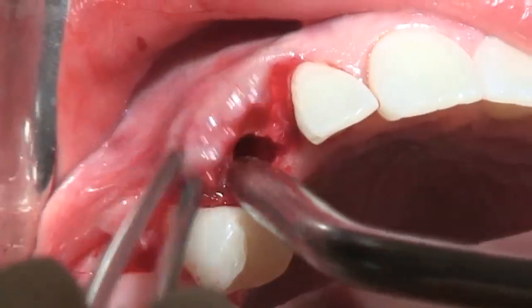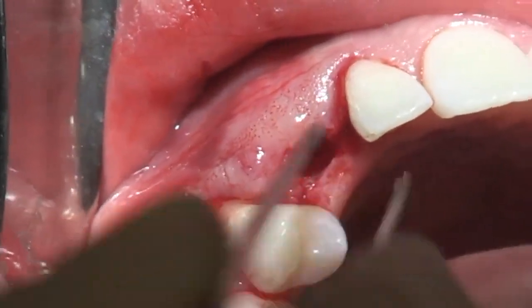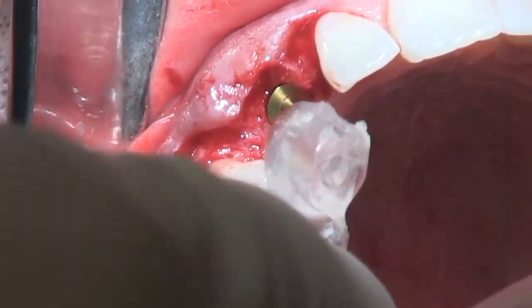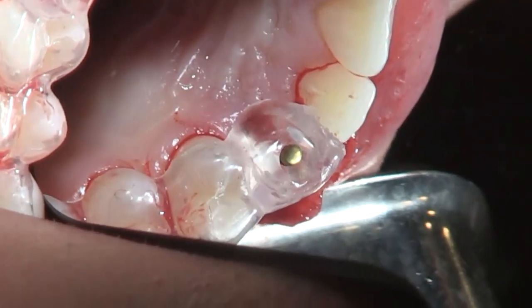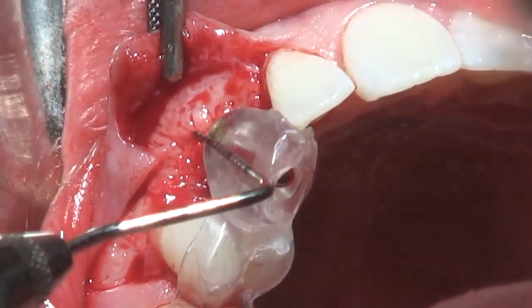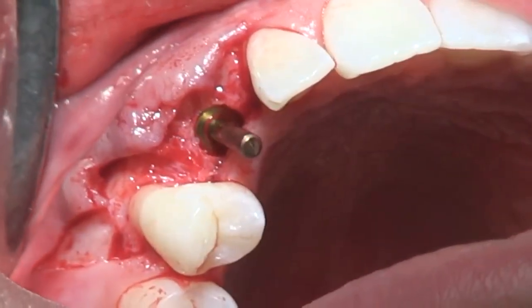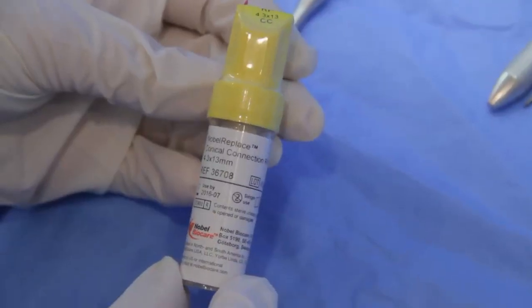The surgical flap is evaluated for tension-free closure, and then final check of the position using a direction indicator and the surgical guide shows the optimal position of the implant in relationship to the crown. Good bone surrounding the implant at the crestal area, and now we're ready for the implant.